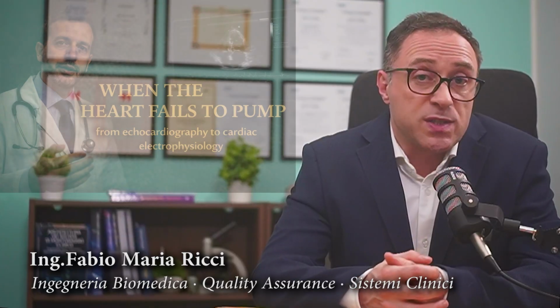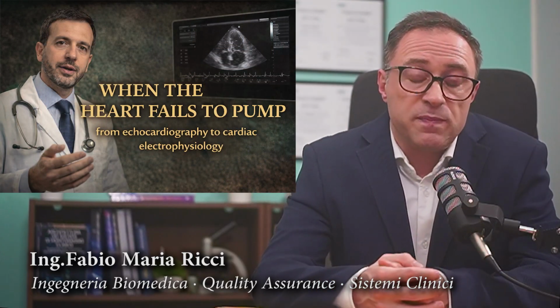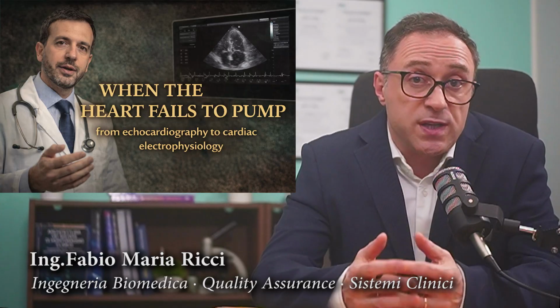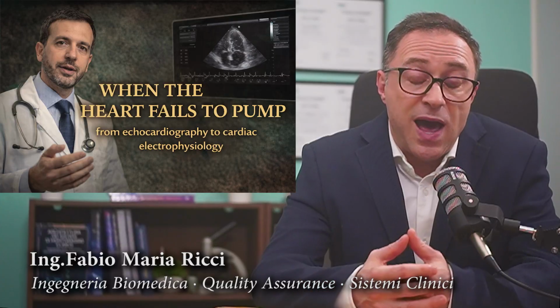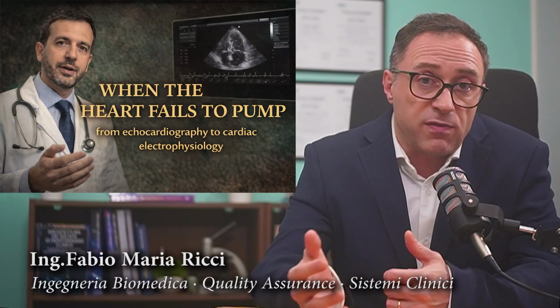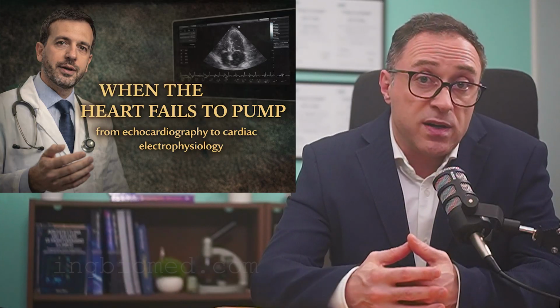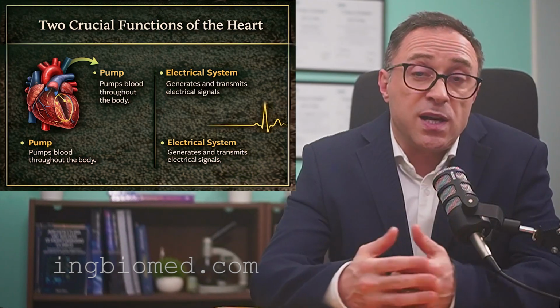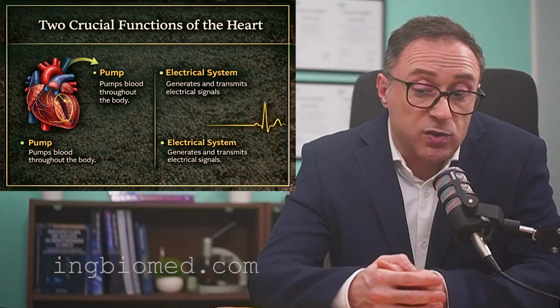Hello, everyone. Today, I want to guide you through a practical cardiac ultrasound session, focusing on left ventricular systolic dysfunction and showing how what we see on echo is strongly connected with electrophysiology and, in some cases, pacing therapy. I will approach this as if we are working together on the ultrasound system. Before starting with imaging, I always like to recall a few key concepts about how the heart works.